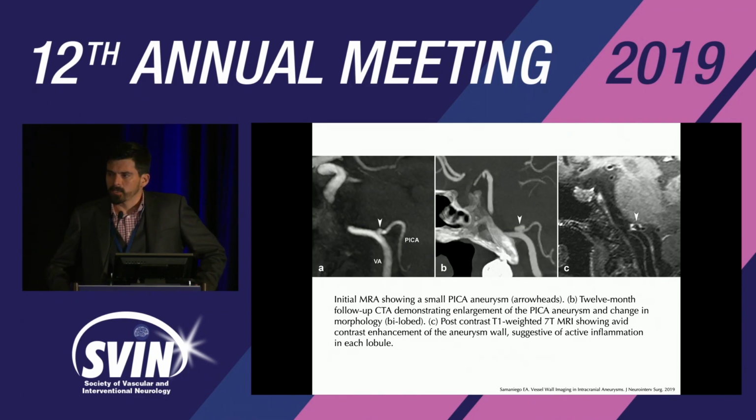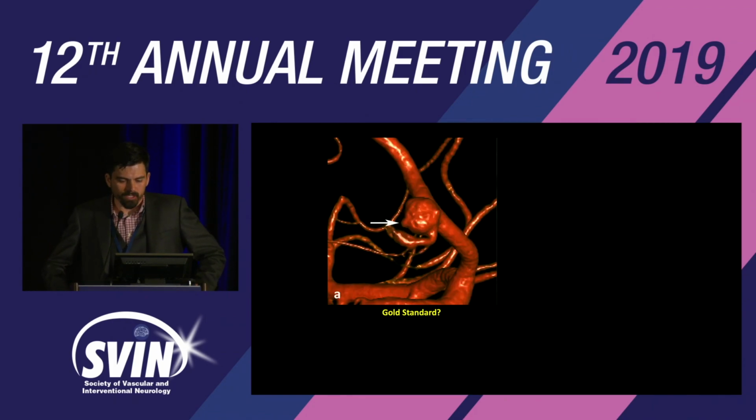We did a high-resolution 7T MRI, and we found this diffuse enhancement of the whole vessel wall of the aneurysm. So definitely something there, something happening. We think it's an inflammatory process. But that's not just part of the picture.